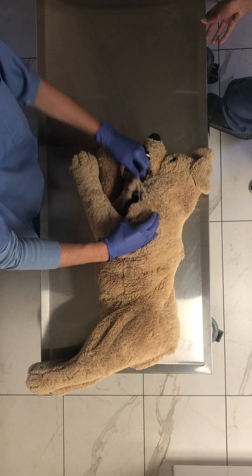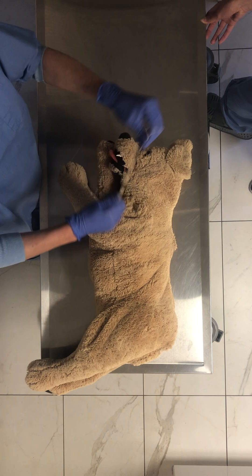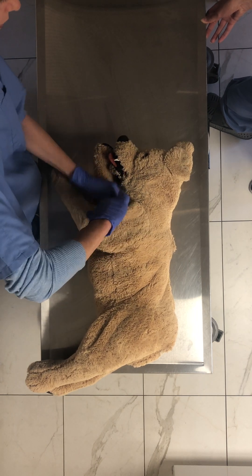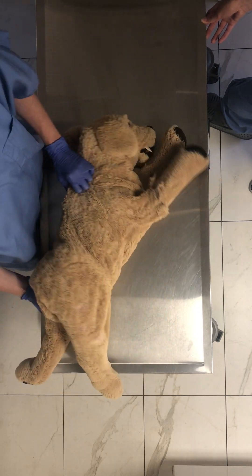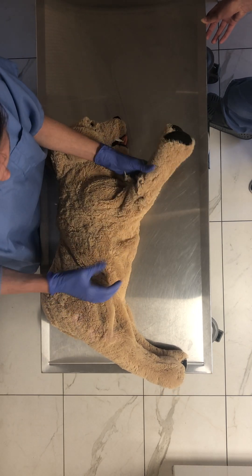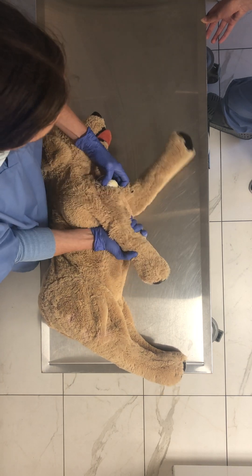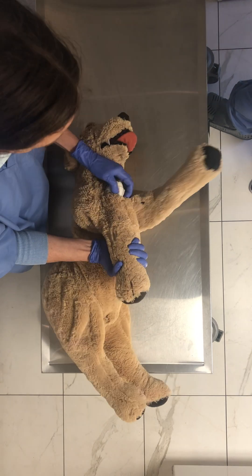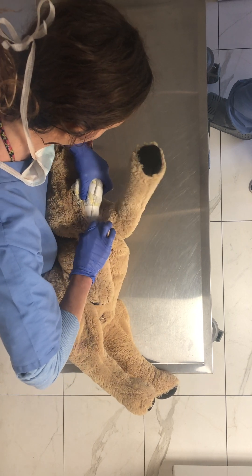And then I just kind of zip him up. So now he's got some recoil. And then the veins — oh, I forgot to show you the veins. So the veins, we use IV tubing and it's filled with betadine.